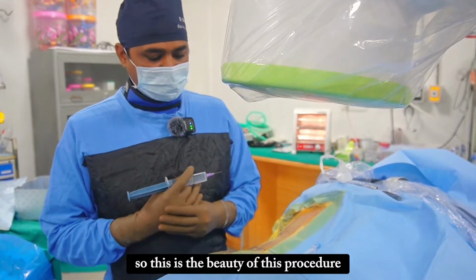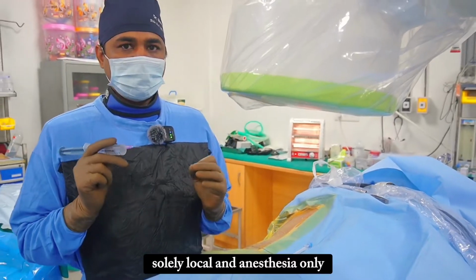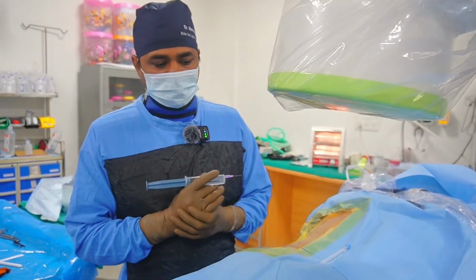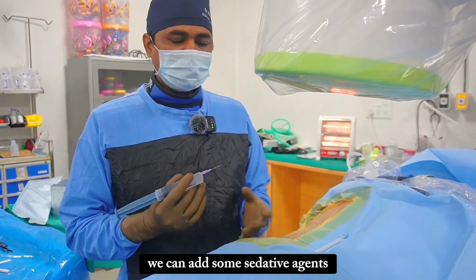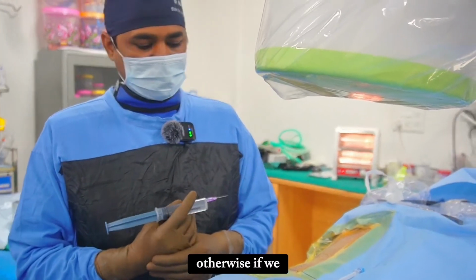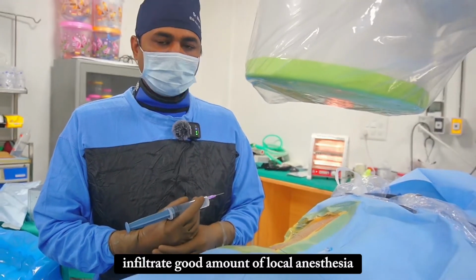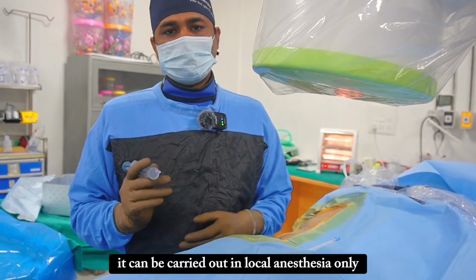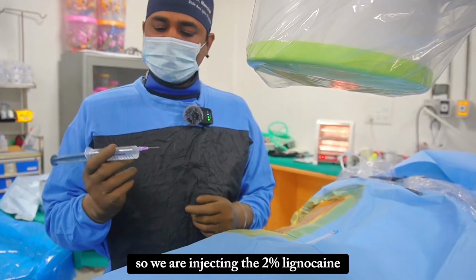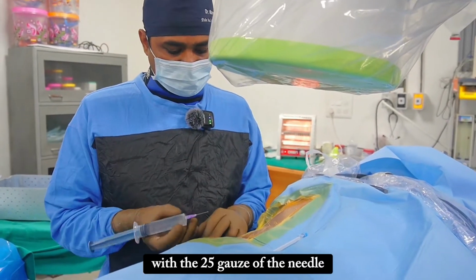So this is the beauty of this procedure, and we do it solely in local anesthesia. Sometimes if the patient is overly apprehensive and anxious, we can add some sedative agents. Otherwise, if we infiltrate a good amount of local anesthesia, it can be carried out in local anesthesia only. So we are injecting 2% lignocaine with a 25 gauge needle.